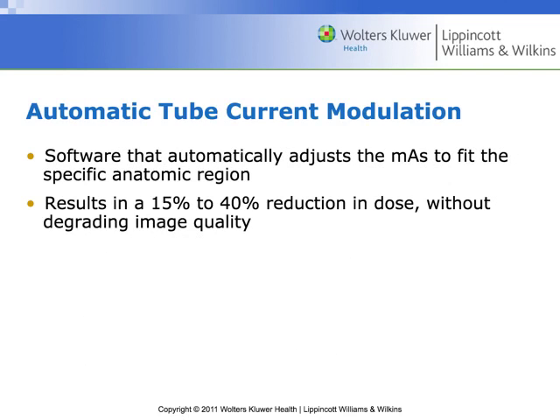Okay, this is a powerful tool. Automatic tube current modulation is a powerful tool in helping us establish that in CT. A related thing in diagnostic X-ray might be automatic exposure control. In radiation therapy, I know that as you're taking portal images, it has a similar kind of automatic exposure control where it cuts off the portal imaging system when it's received enough intensification to make an image, right? I don't know if there's a related kind of concept in nuclear medicine, so if y'all think of something, shout it out.